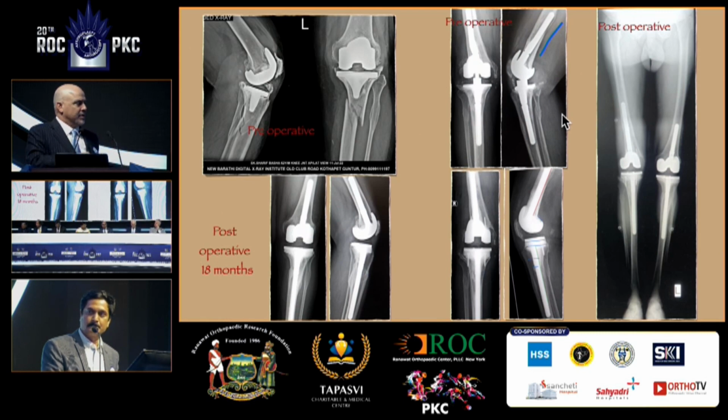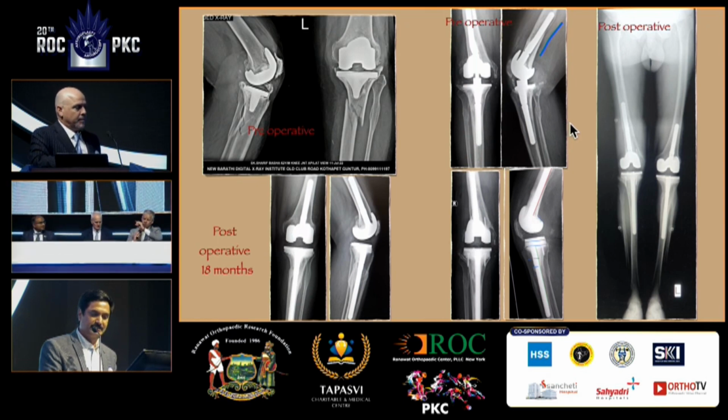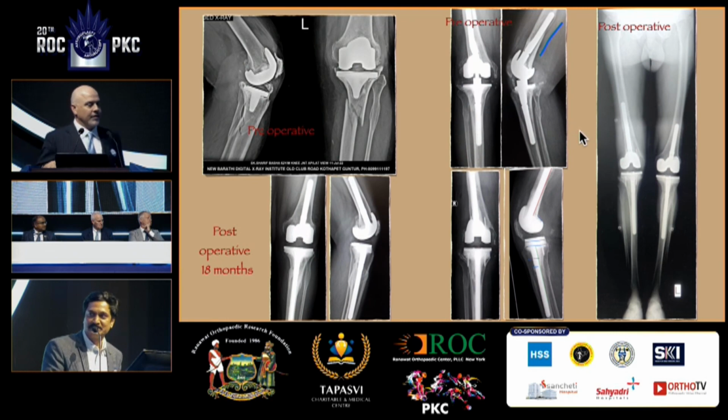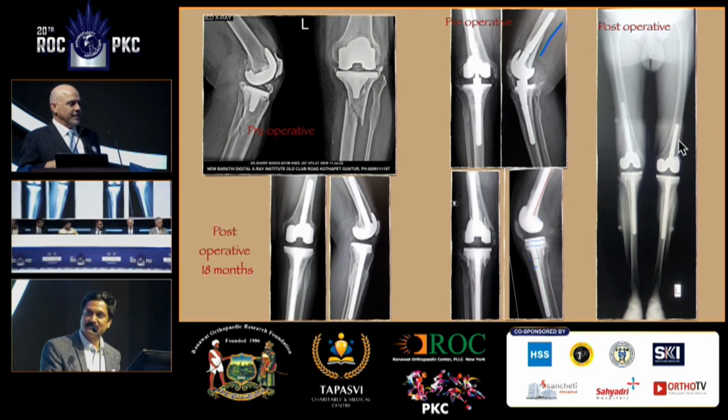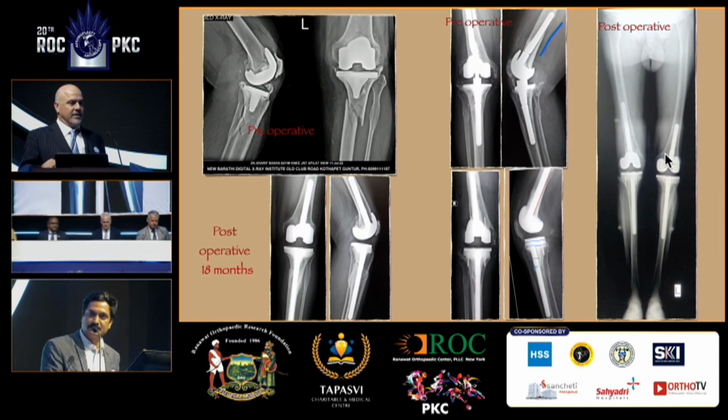because you now have a problem if that medial epicondyle breaks. Yeah, but every system, this system has augments. Yes, and you could use augments in the femoral part. 100%. And you can bring it down, and you don't have to build it up on the tibial part. I 100% agree. As you said, it's correct. The patient is very poor, so budget is low. I cannot use sleeve stems, so I managed with screws and cement. Then it's clear. Okay, excellent.